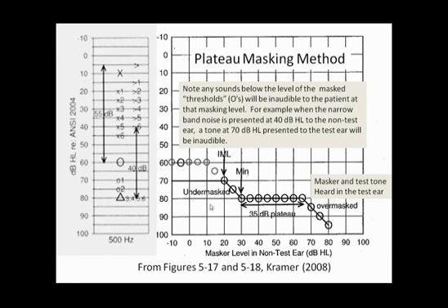All we did was add noise and then ask the patient, can you hear it? No, you can't hear it. Okay, we raised the level up 5 dB. You hear it? Okay, great. Then raise the level of the noise up, etc. So these aren't really true thresholds, but we're going to handle this data as though these are thresholds.